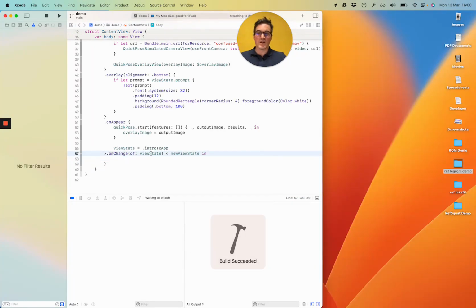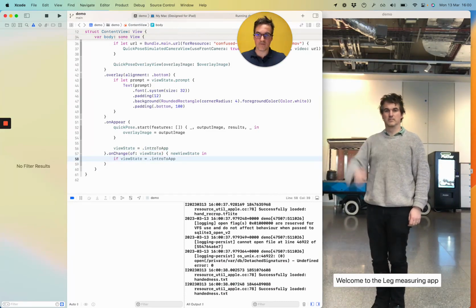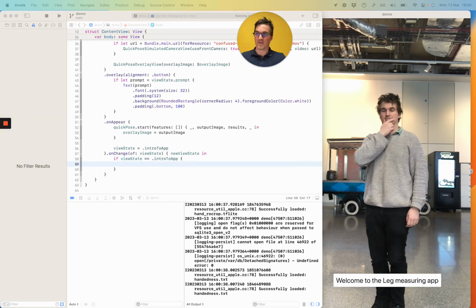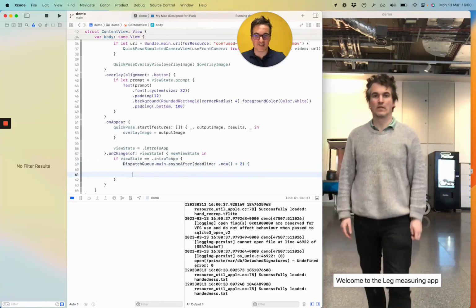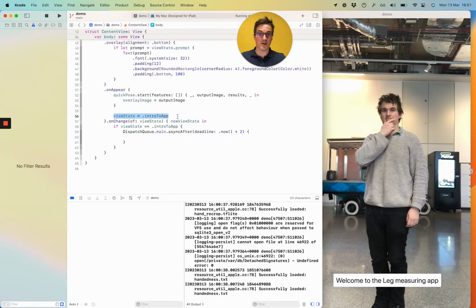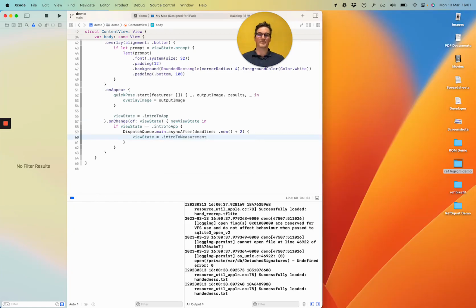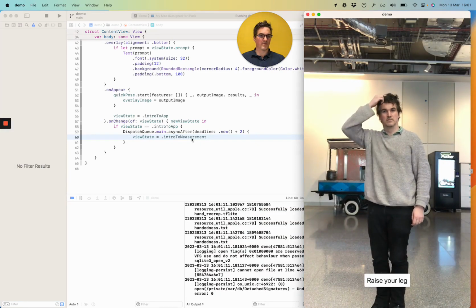Okay, so that means whenever the view state is set to intro to app, we can then set a delay. So I'm just going to copy this line in because it is very confusing. It's just a bit of boilerplate to say delay, and notably it runs on the main thread, so you can run UI functions in it. So after 2 seconds, I want it to change to intro to measurement. Raise your leg. Great.